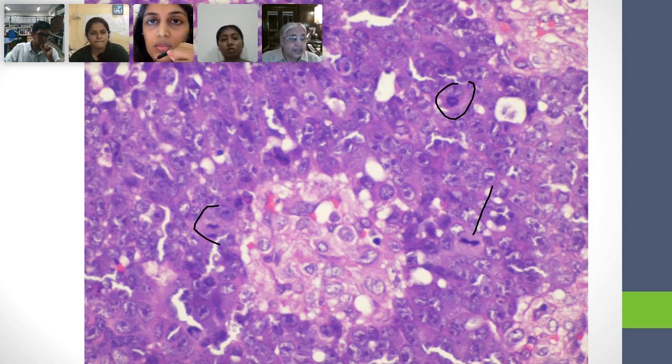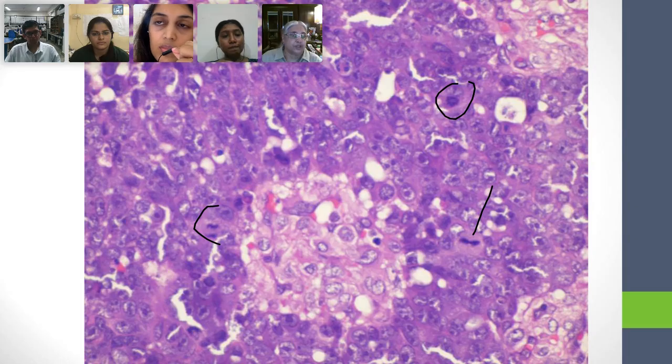Please understand that. You have to look for mitotic figures, starting from prophase all the way to telophase, within the cytoplasm. It is not inside. Yes, the contents of the nucleus, which is the DNA, the chromosomes, are undergoing these divisions, because mitosis is not the same thing as DNA replication. Do you understand that? While DNA replication in the S phase is occurring, it is occurring within the nucleus.